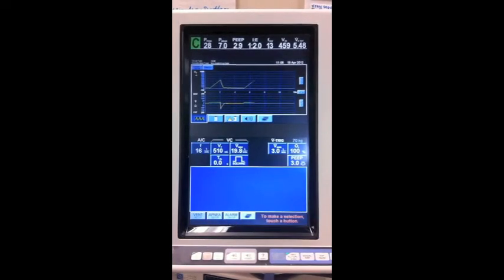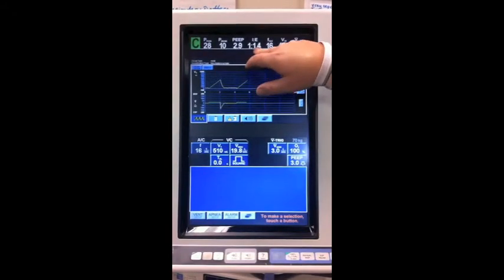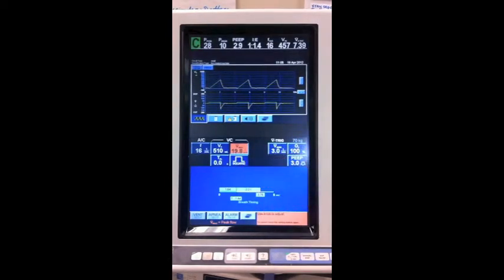I was told yesterday that I to E should ideally be like 1 to 3. Yeah, 1 to 3 is average. So you really have to pay attention. Here we got a 1 to 1. We have an incredibly low flow. Our flow is only 20 right now, and our waveform is a square.